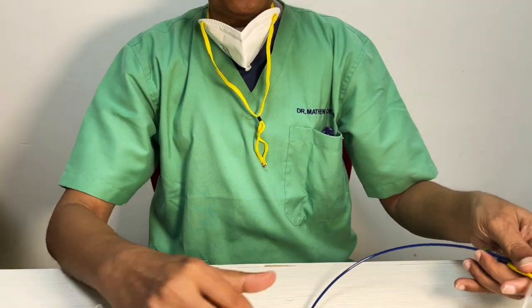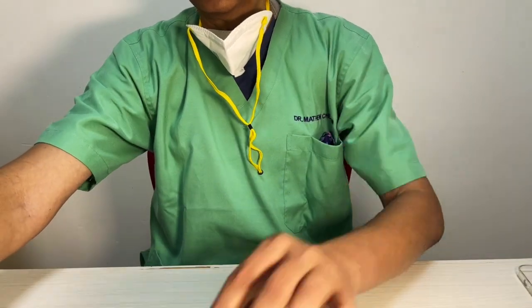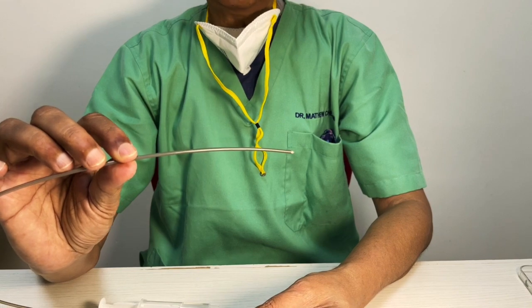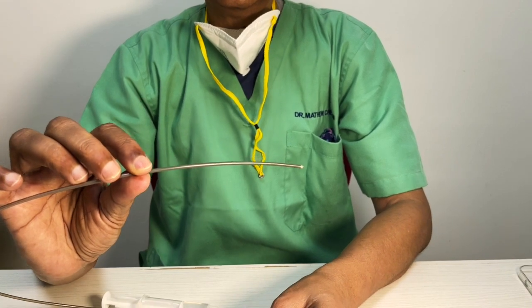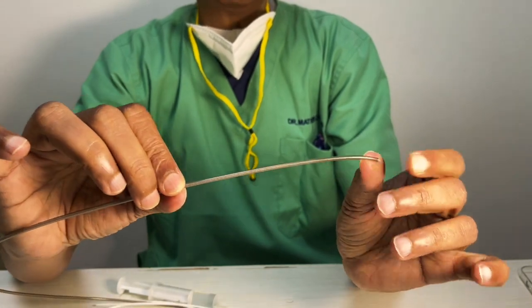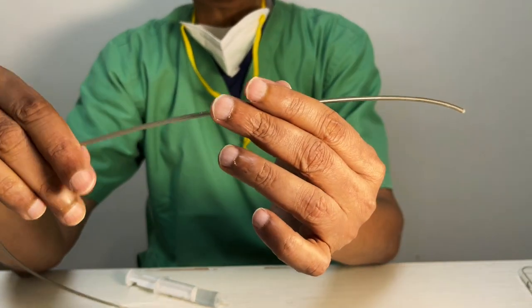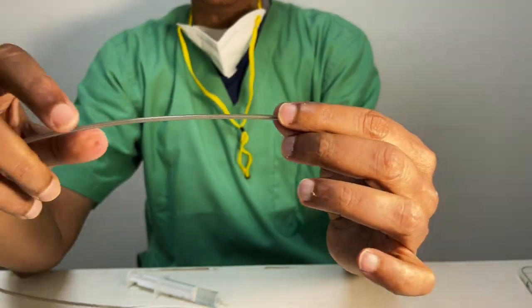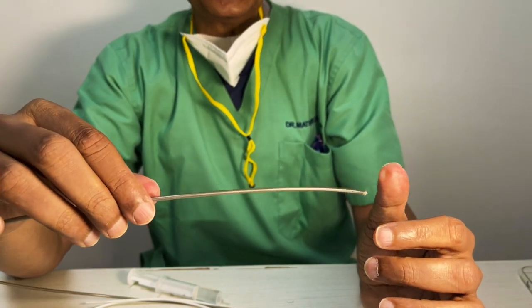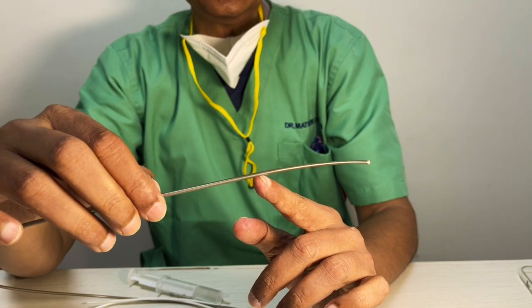Then comes the Infinity platform, which is also a guiding platform, a long sheath platform, which is made by Stryker. So this is also very similar. Again, it has these multiple zones. You can have a look at why these behave as they do. And always know that these long sheaths come in different lengths. So if you think that you're not going to go very, very high, try to take a long sheath with 80 centimeters.